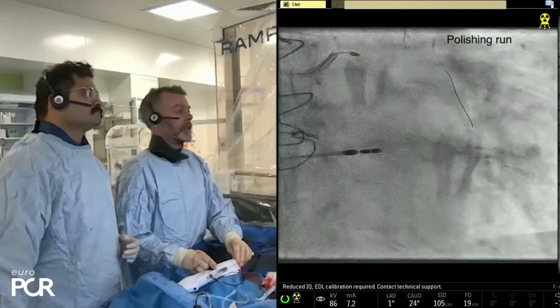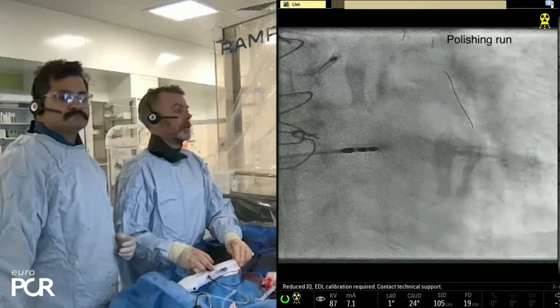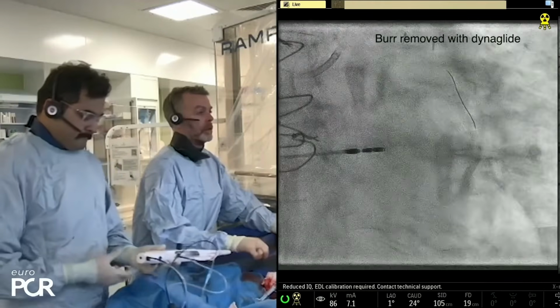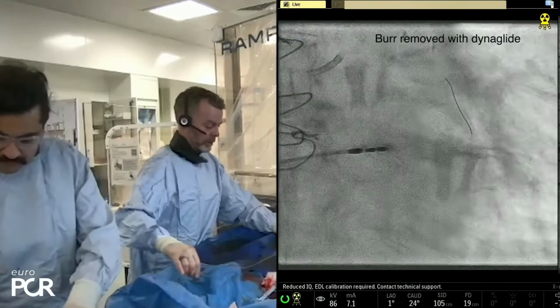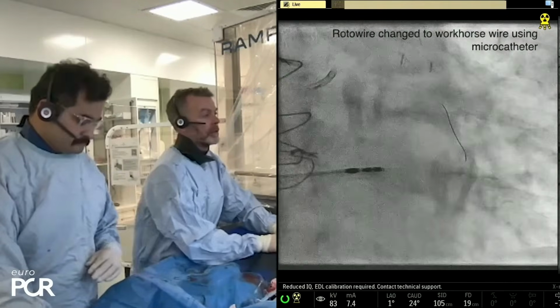We get a little bit of deceleration at the top, don't we? Yeah, the left main, isn't it? Left, right, more than 2 secs. You go off.